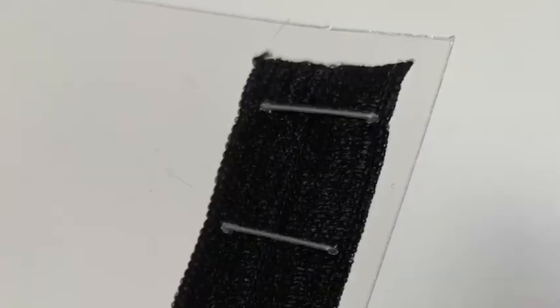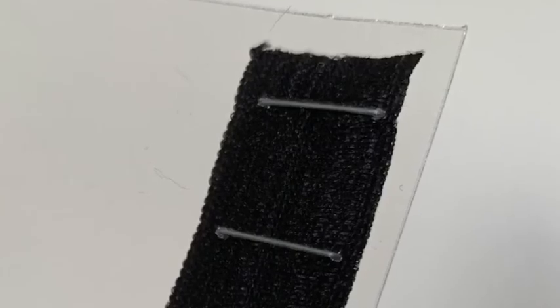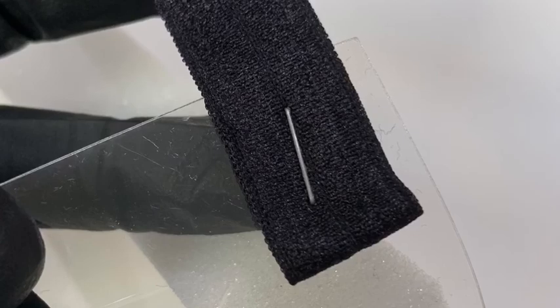And that is the process and how we make the face shields. It goes by really quick, and they're really easy to make. And here you can see the first step of the elastic in the corner with the 2 staples, and then once it's folded back over with the second horizontal staple securing it.